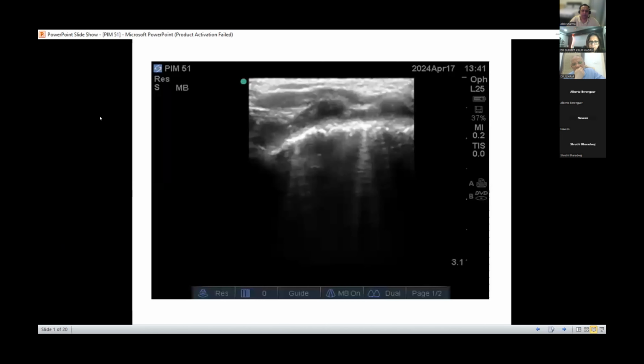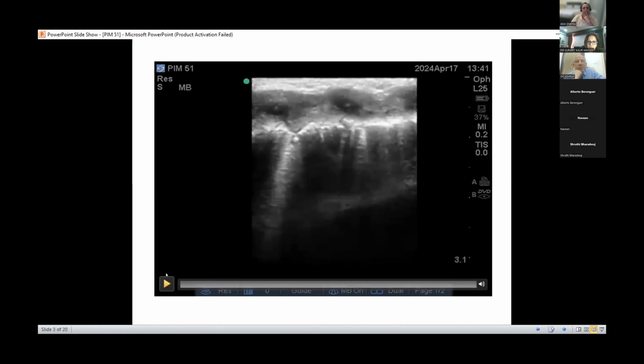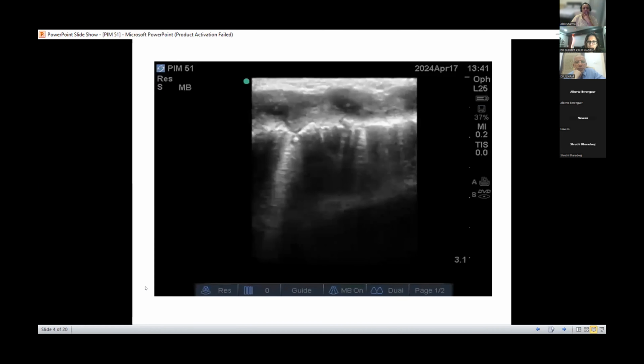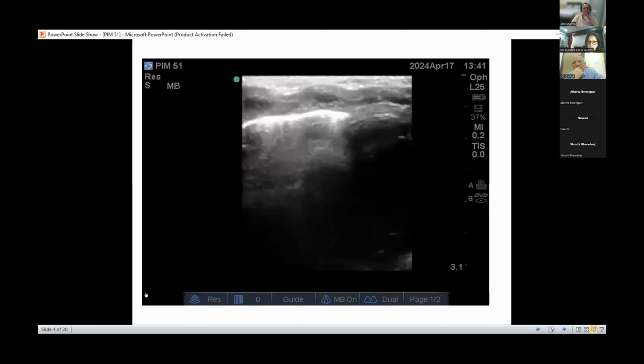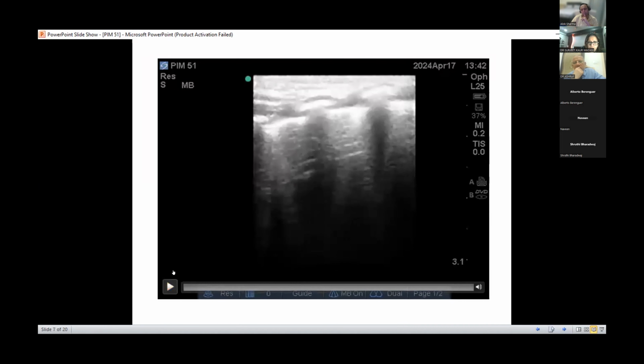And this was, I thought of RDS and I did a scoring. And this was in R1. So I could score it as 1. These were 6 regions, R1, R2, and the axillary area. And R2 was again, I scored it as 1. And R3 again was almost 1. And so this is, I think, left side. So these are 6 regions which I scored, and almost it was having a similar picture.